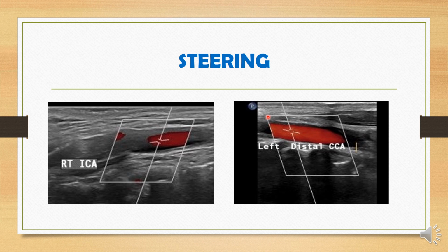Steering is very important, otherwise the color flow will not appear good on your screen and the spectral waveform will not be so sharp.